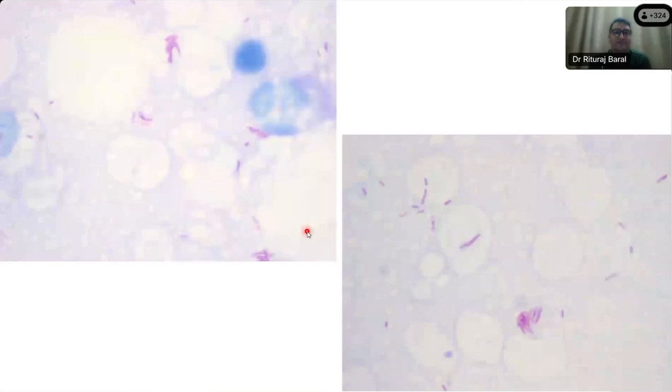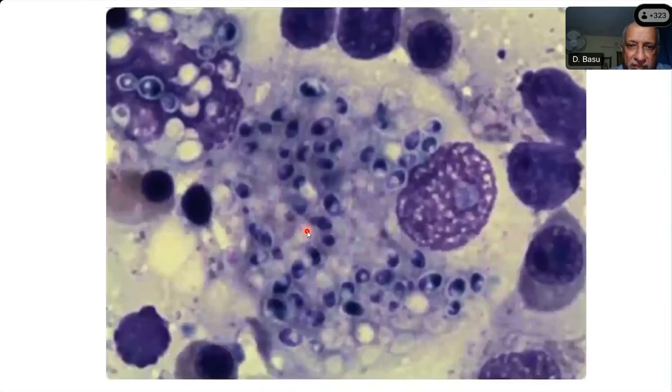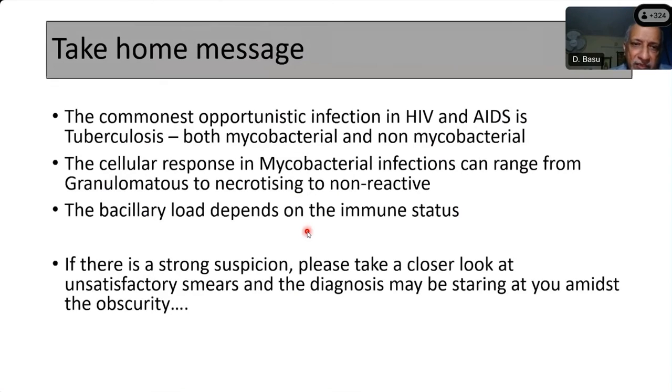Then yes, the mycobacteria. What are the other acid-fast organisms other than tuberculosis? Any other organisms? Nocardia, which are of this shape, right? Nocardia, elongated. Otherwise, any other? Lepra bacilli. Okay, lepra bacilli. Cryptosporidium, very good. Cryptosporidium, right. Okay, so I think any other questions, Sindhura? Yes, sir.